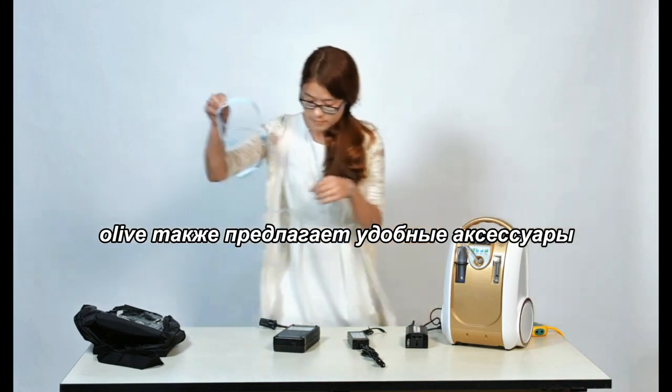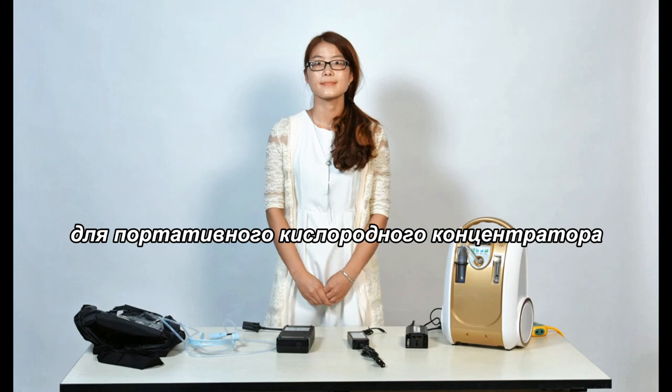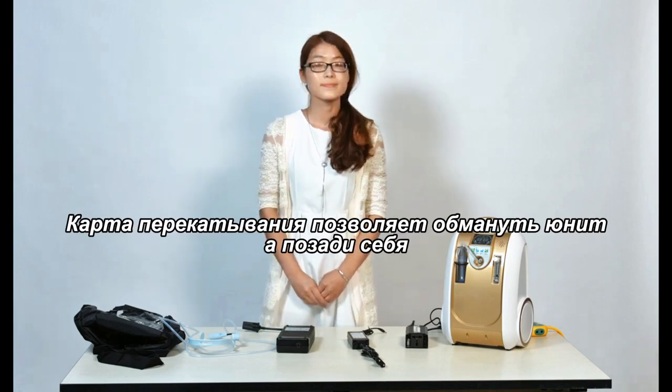The Olive also offers convenient accessories for the portable oxygen concentrator. The rolling cart allows you to pull the unit behind you.